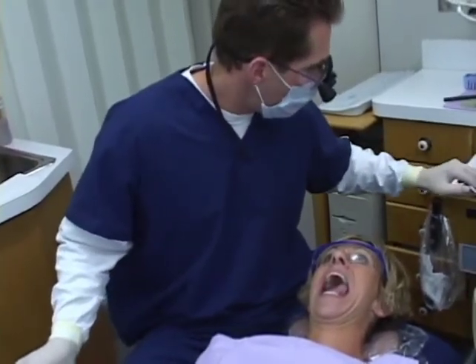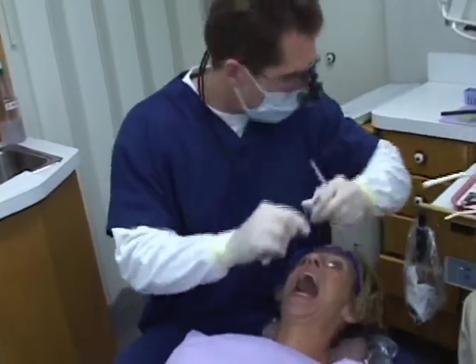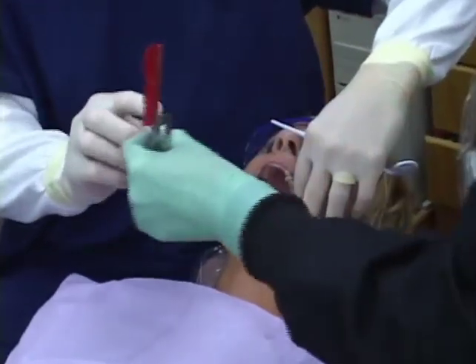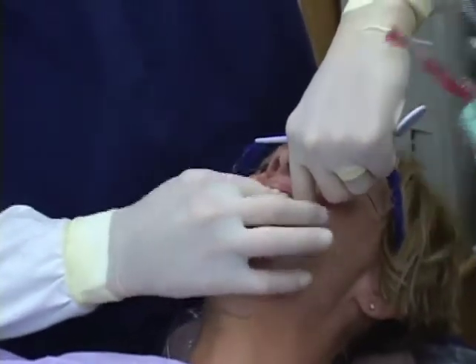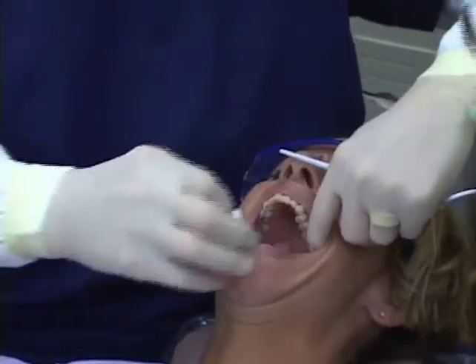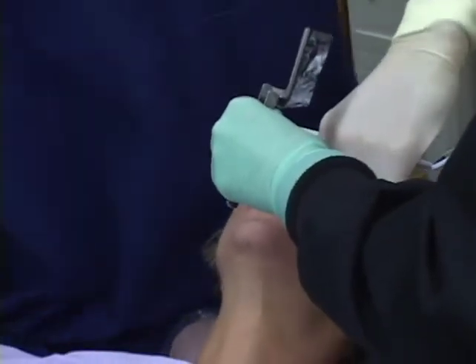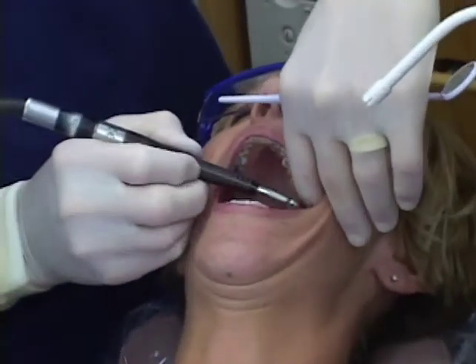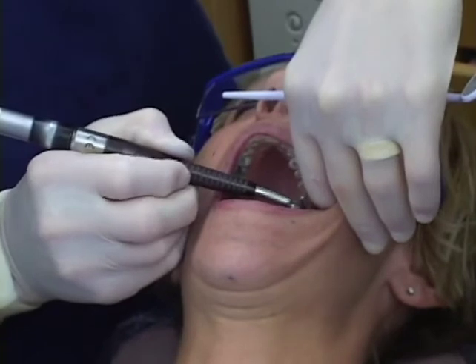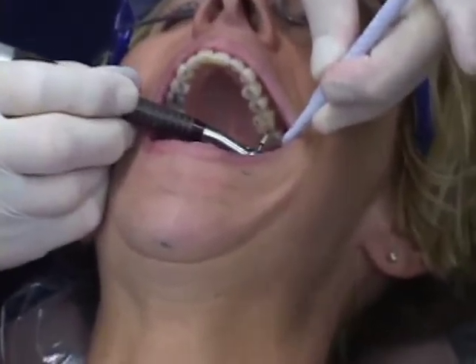We've got some blue marks all over the place here, so we need to clean that up. Let me tap on these teeth, Debbie - see if you can get the sense of which tooth it is. I'm going to tap on all the contacts I see. Open. If you can zoom in, you can see we do have a pretty heavy contact here on tooth 14. I'm going to go very lightly - almost using a pencil eraser. This is very, very subtle.